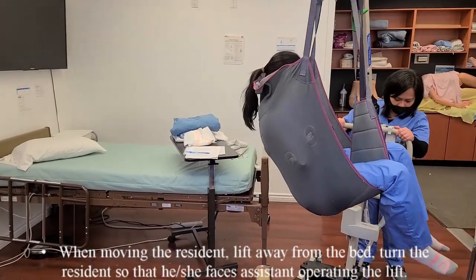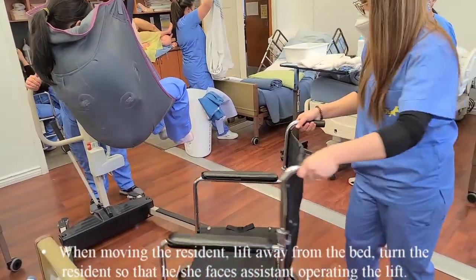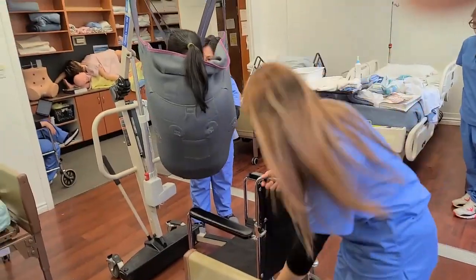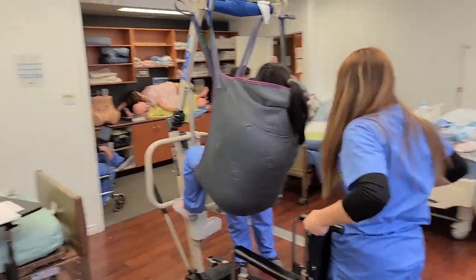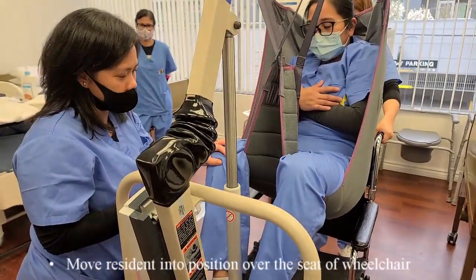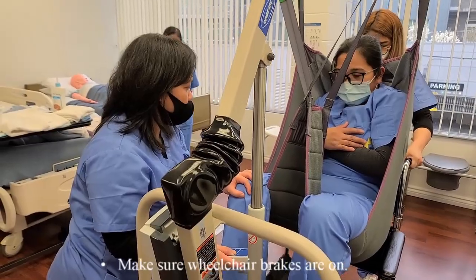When moving the resident lift away from the bed, turn the resident so that he or she faces the assistant operating the lift. The self-leveling cradle will bring the resident into a sitting position. Move the resident into position over the seat of the wheelchair. Make sure wheelchair brakes are on.